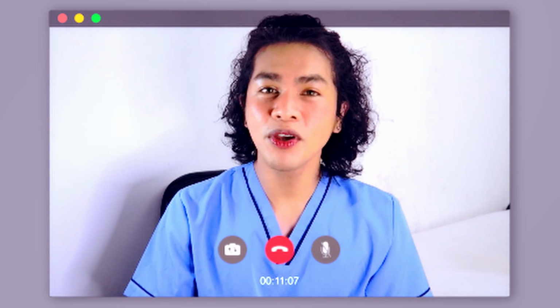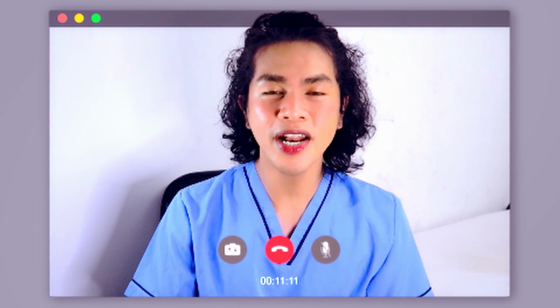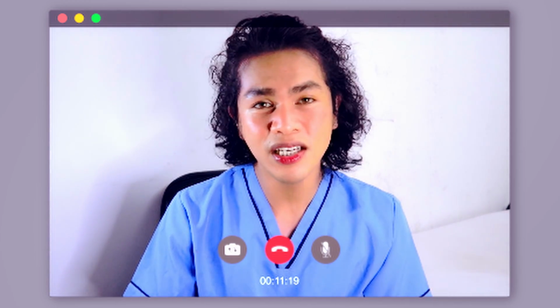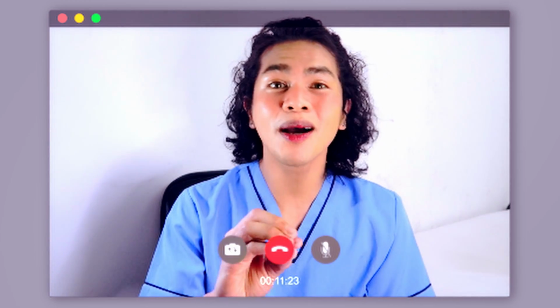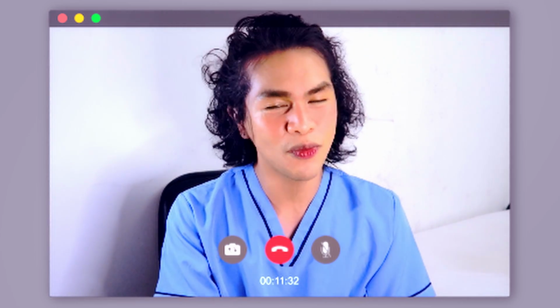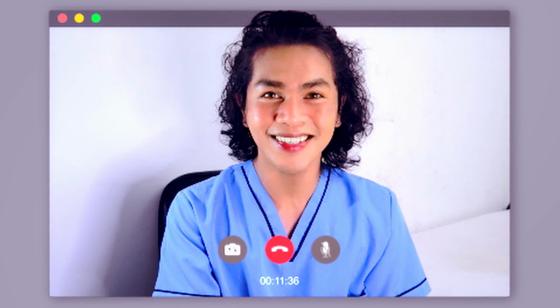In this video, I'm gonna give you a thorough nursing procedure discussion about your ECG. Yes, paano mo nga ba gagawin yung ECG at saan mo nga ba ilalagay yung tamang placement ng mga probes and electrodes? All of that and more in one video. If you wanna know more about that, stay tuned.